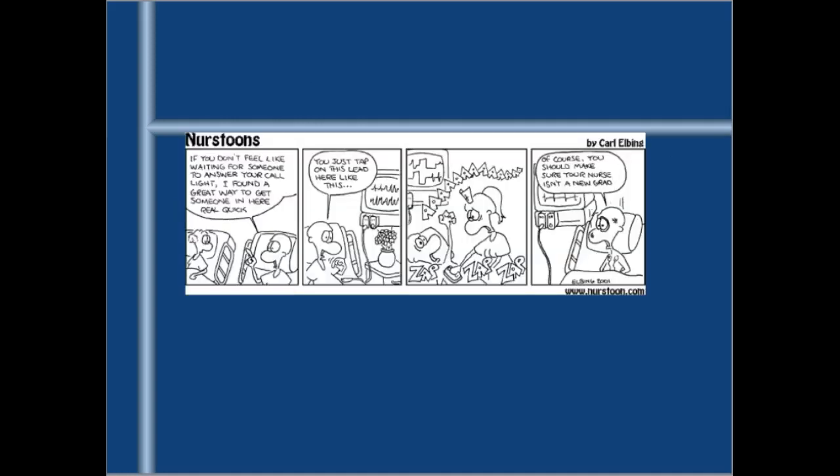So this cartoon is no joke. I had to laugh when I saw it. You can actually mimic VTAC by tapping on your leads, and that used to be a joke when I was new, that people would pull on me, and I fell for it every time. So don't fall for that.